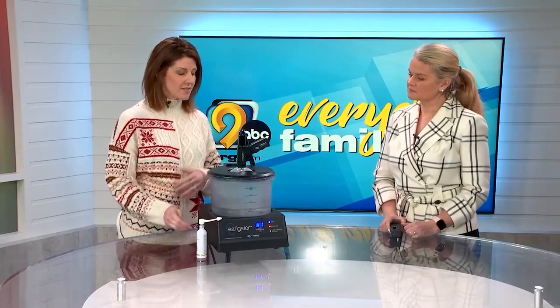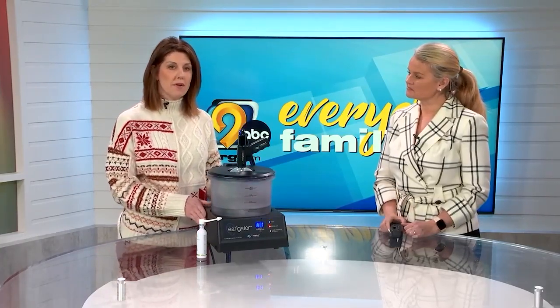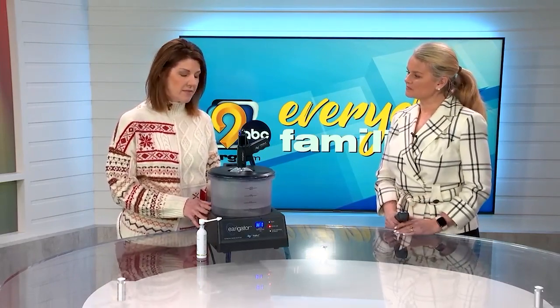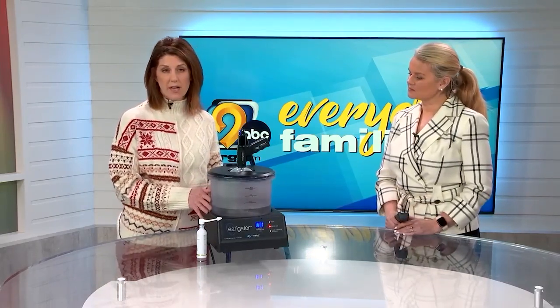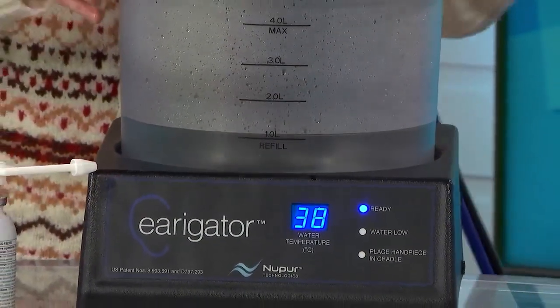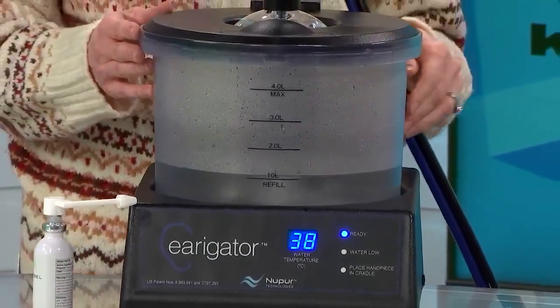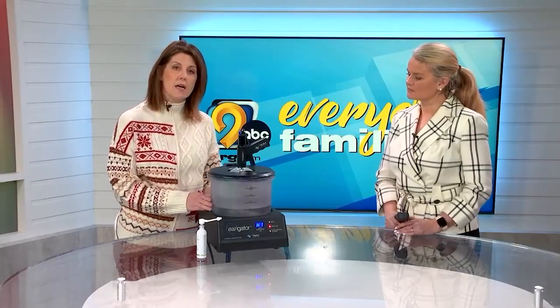This machine here is called the Irrigator, and I purchased this several years ago. It's probably one of the machines I use the most in my office. It is a state-of-the-art irrigation machine. It warms the water up to body temperature, because if water is too hot or too cold and you put it in your ears, it can create vertigo or really bad dizzy spells. So it warms it up to body temperature, which is also just a more pleasant sensation. The safety valve uses a safe amount of pressure to safely flush the wax out of the ears without the risk of harming your eardrum or ear canal, which is really important.